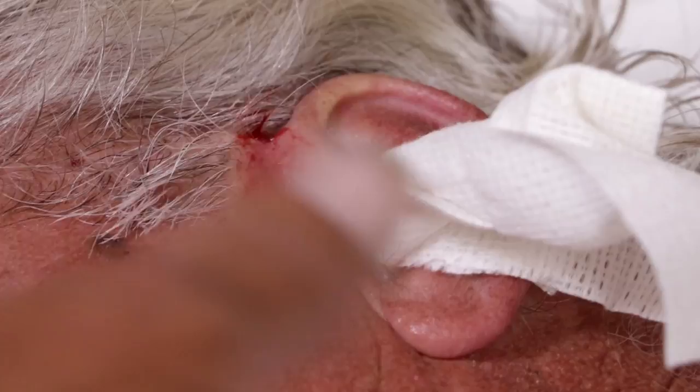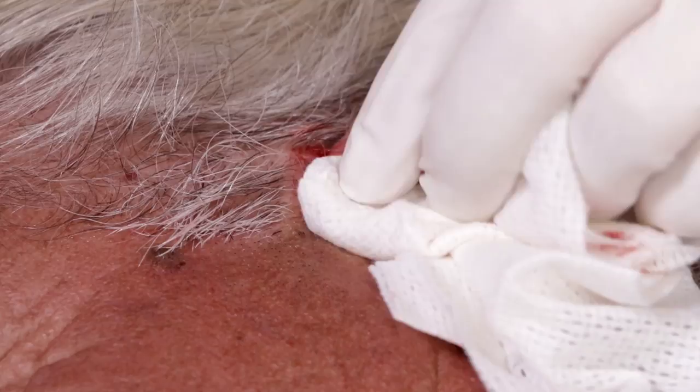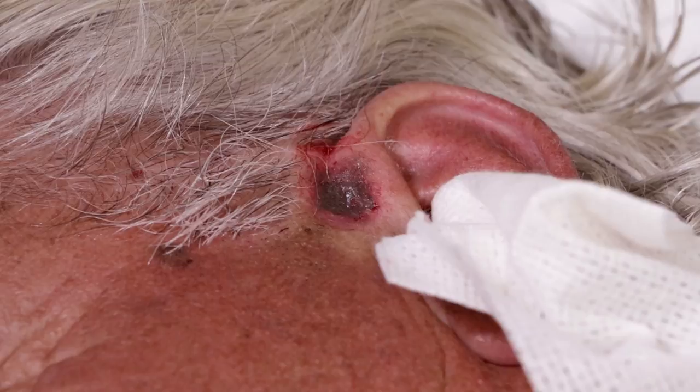Alright, we didn't see any light shining through there — we didn't go that far. This is where the screaming starts. I'm pushing kind of hard; the reason I'm pushing hard is to push all the blood out because cautery doesn't work well in a wet environment. Alright, so that's one pass done.